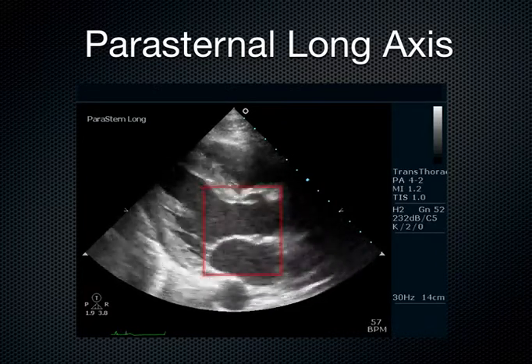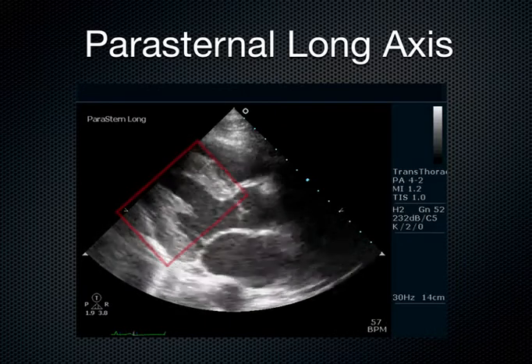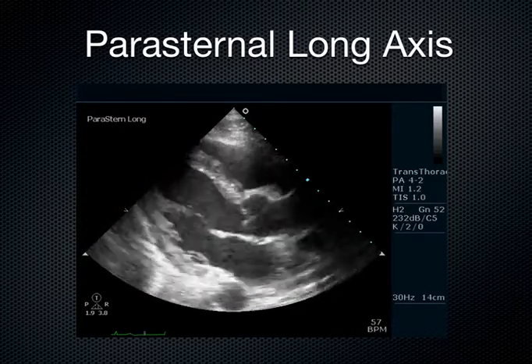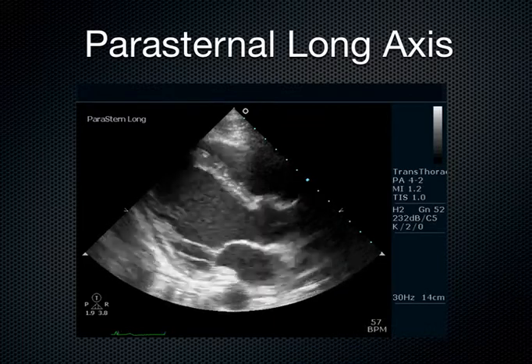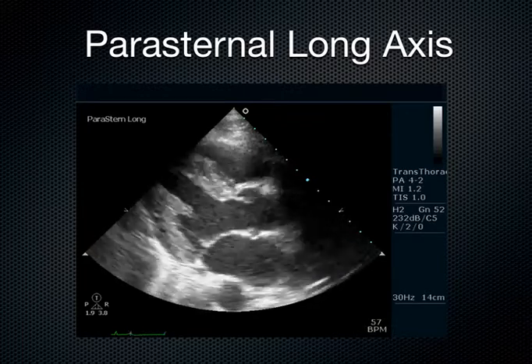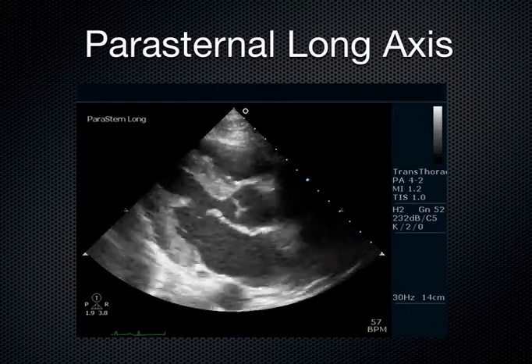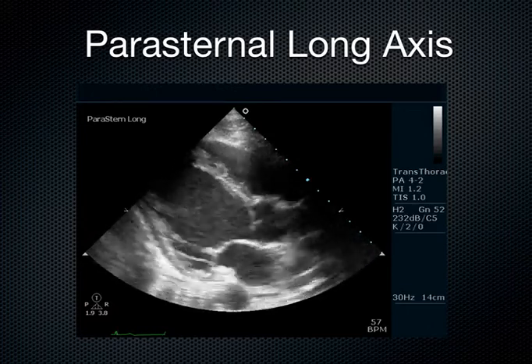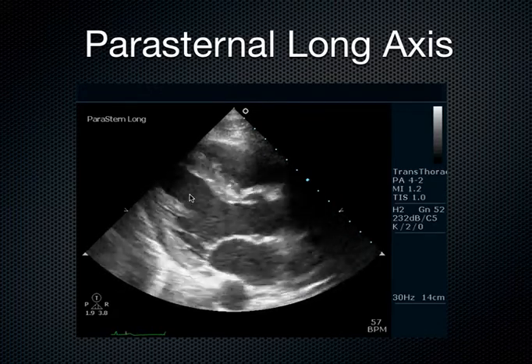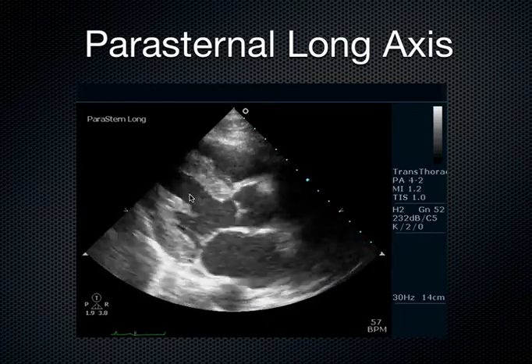So again, I look at the anterior septal leaflet of the mitral valve, and I go ahead and look at the posterior wall and the interventricular septum and how well they squeeze towards one another. And clinically, the way I would use this is, let's say this patient had low blood pressure, and I'm trying to decide what to do next. Generally speaking, I can give more fluids to try to get the patient back up on that Starling curve. Or occasionally, the heart doesn't beat strong enough, so I have to be very careful with fluids. You see, because if the left heart doesn't beat strong enough, you can get buildup of fluid into the lungs, resulting in pulmonary edema.